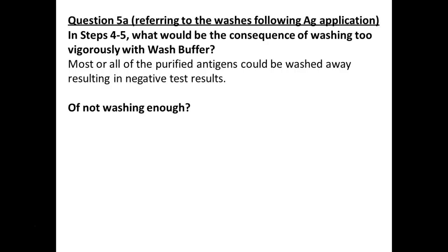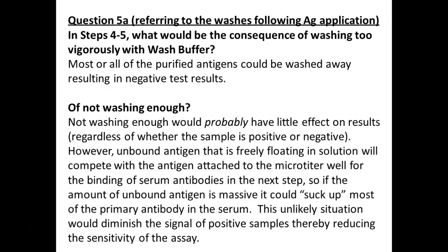So this test can actually be done quantitatively, where we actually get a number. We could put it on a spectrophotometer and get a number for about how much color is produced, which would give us about a number for how many antibodies are present. For our purposes today, because I haven't adapted this lab yet for that, though we do have a plate reader next door now that can read a whole plate all at once, we're just doing positive and negative today. But yeah, it would throw off the accuracy or sensitivity of our test if we didn't wash properly.